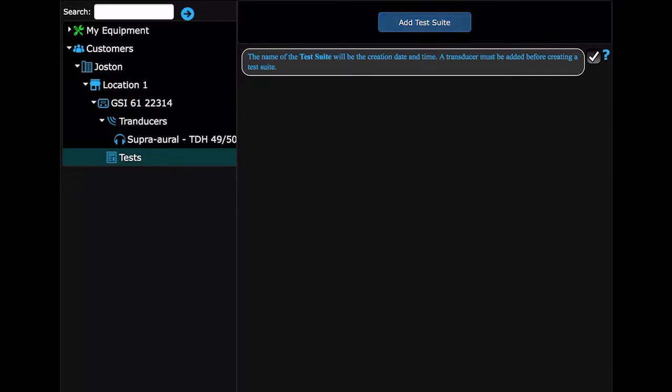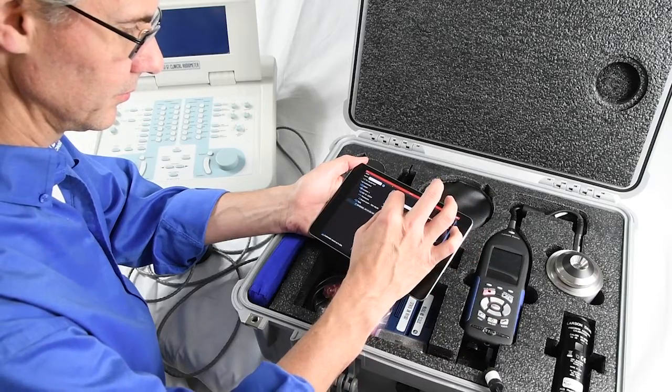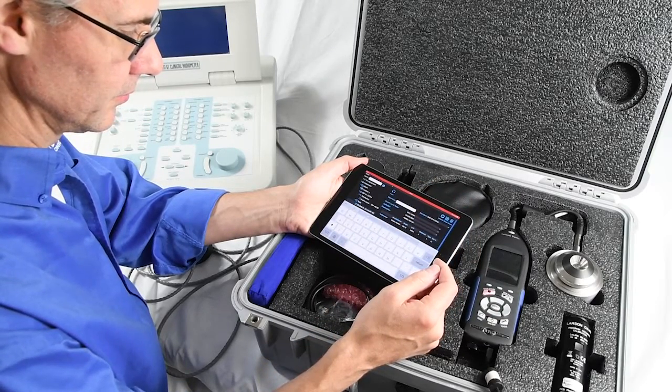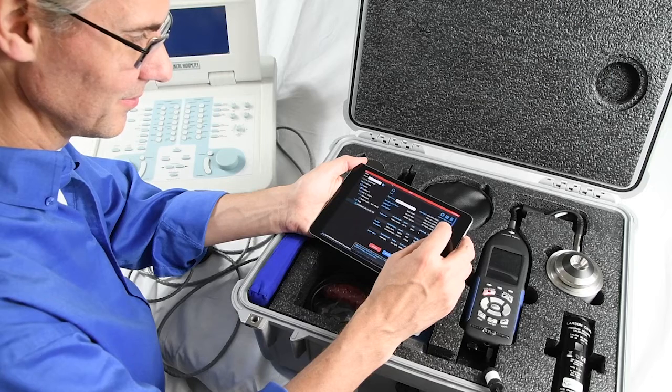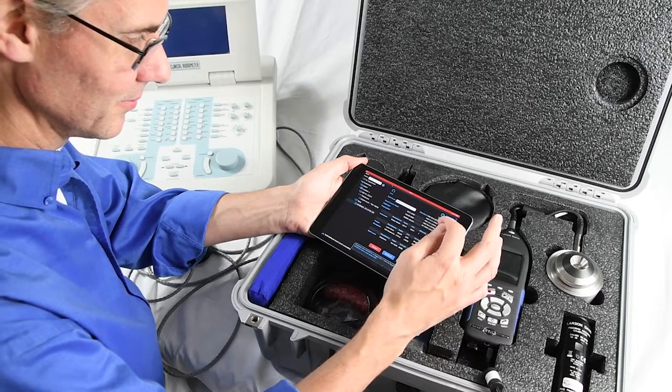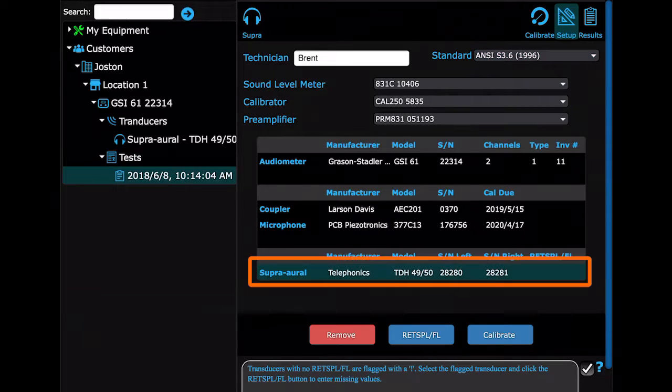Then select Add Test Suite in the main view. You will need to set up the test now. Enter your name, like Brent is doing. Choose a standard you will be testing to. Make sure the correct equipment you will be using are chosen. Then click the transducer and click RETSPL.